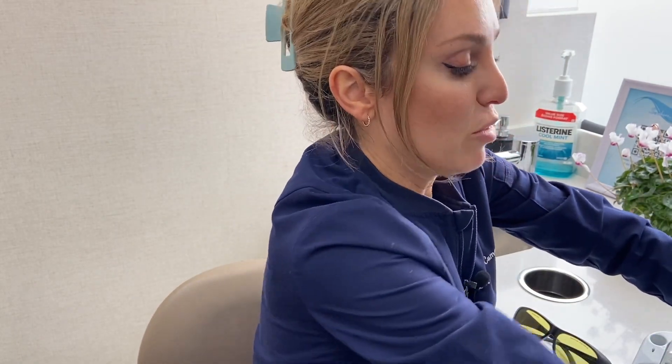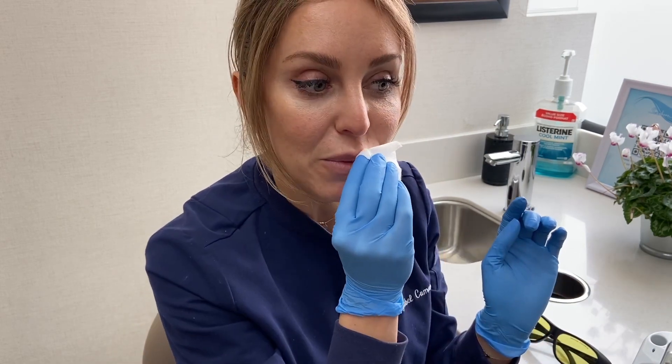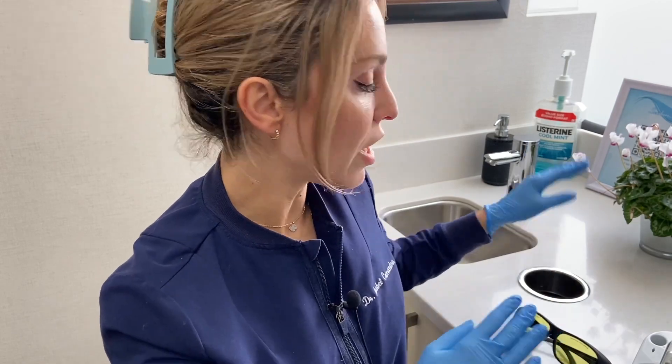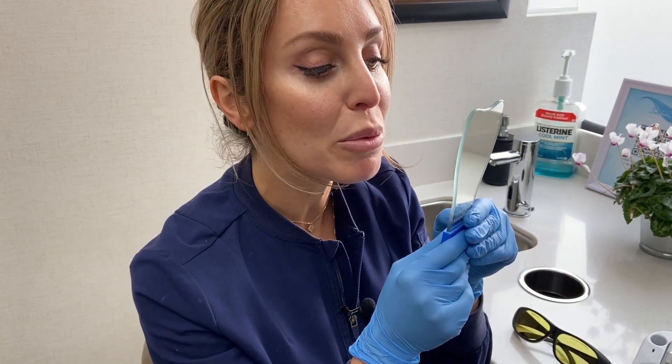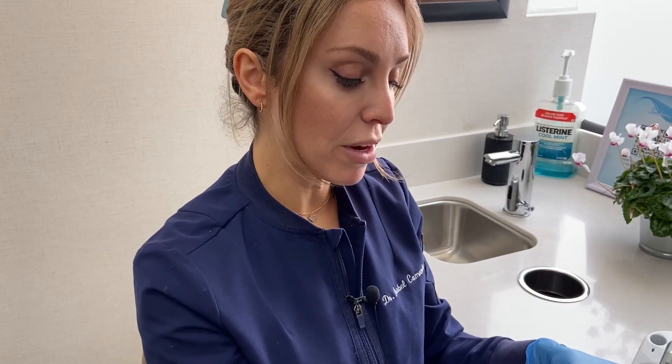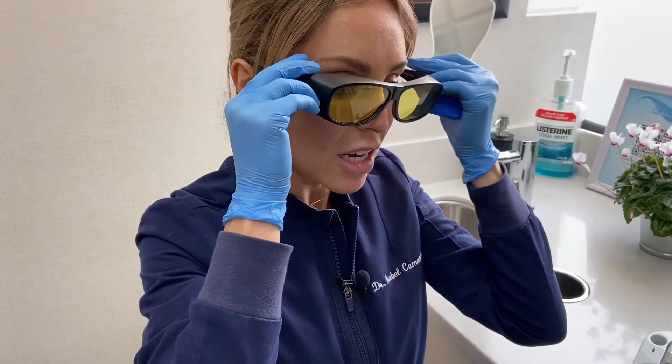I have no numbing, nothing on my lip, and we'll go ahead. So I'm going to attempt to demonstrate the laser on myself. I will be holding a little mirror just so I can see what I'm doing. First thing, I'm just going to use a little bit of alcohol — just wiping the area so it's disinfected. Just let that dry off a little bit, and then I'm going to be wearing my little safety glasses for the laser just in case.